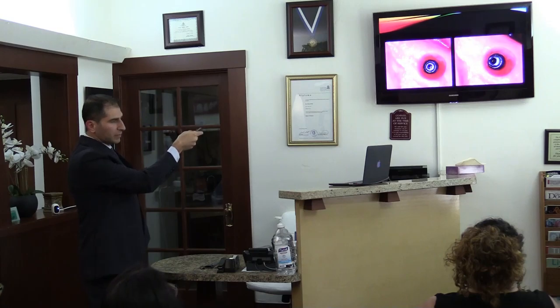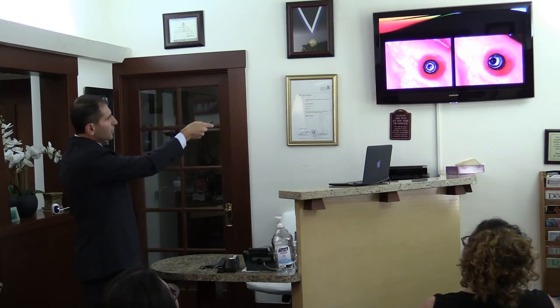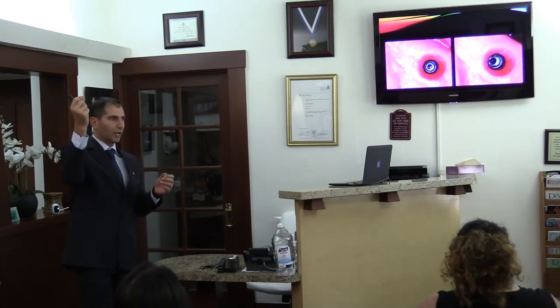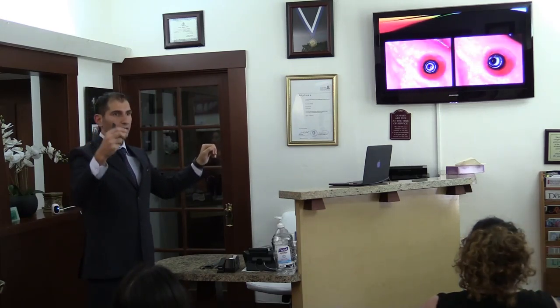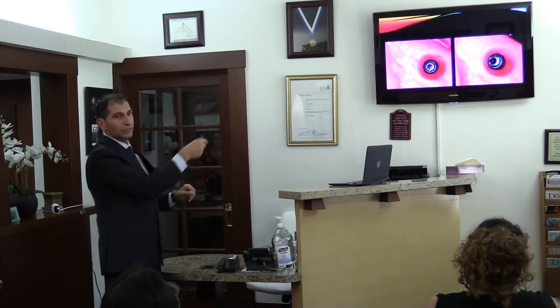On the left I utilize a healing abutment at a second-stage surgery. Now I remove it and this is how the surface looks. When it's pink, it's epithelial; when it's bleeding, that's interaction between the transmucosal abutment and the tissue — and I tear that when I remove the healing abutment. I want to see it with my own eyes, because seeing is believing. With the same patient, Isaac, we took the impression, put the healing abutment back after decontamination and irradiation to make the surface hydrophilic again. This is on the day of delivery of the final crown on tooth #31, all the way in the back.